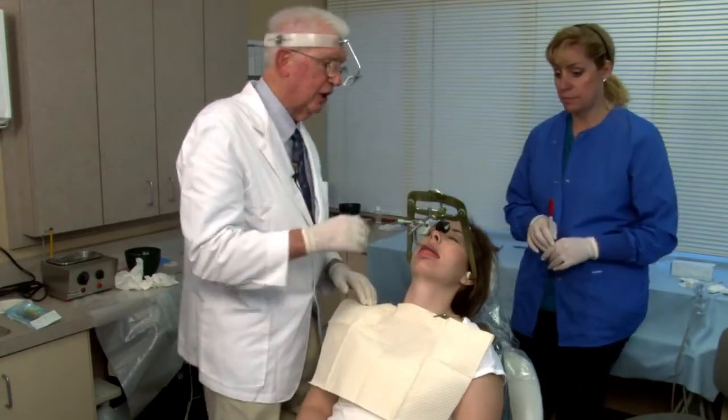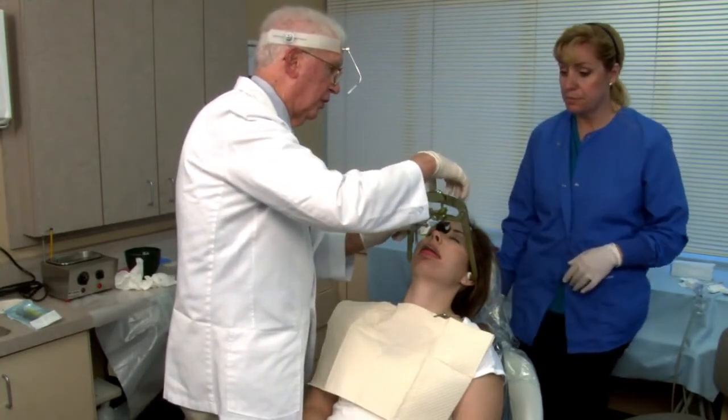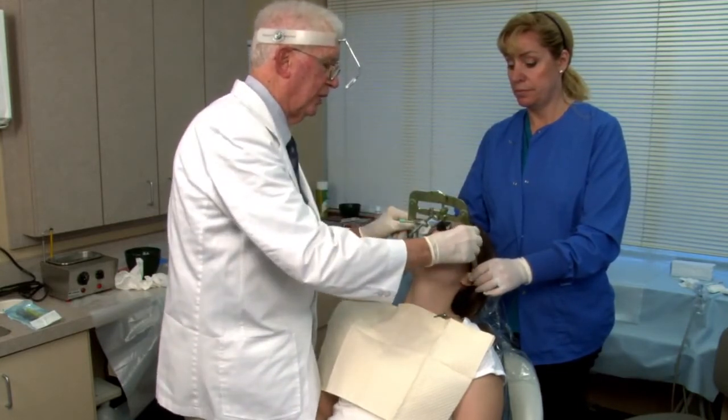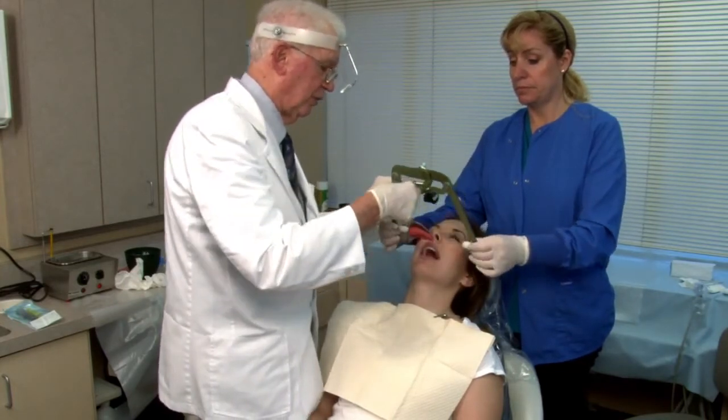Now we can take the ear bow off, and so I will loosen. Okay, Christy, you'll take it out of the ear. I'll loosen the screw here on the front. Christy will open it out of the ears. I will ask the patient to open, and we will remove it.